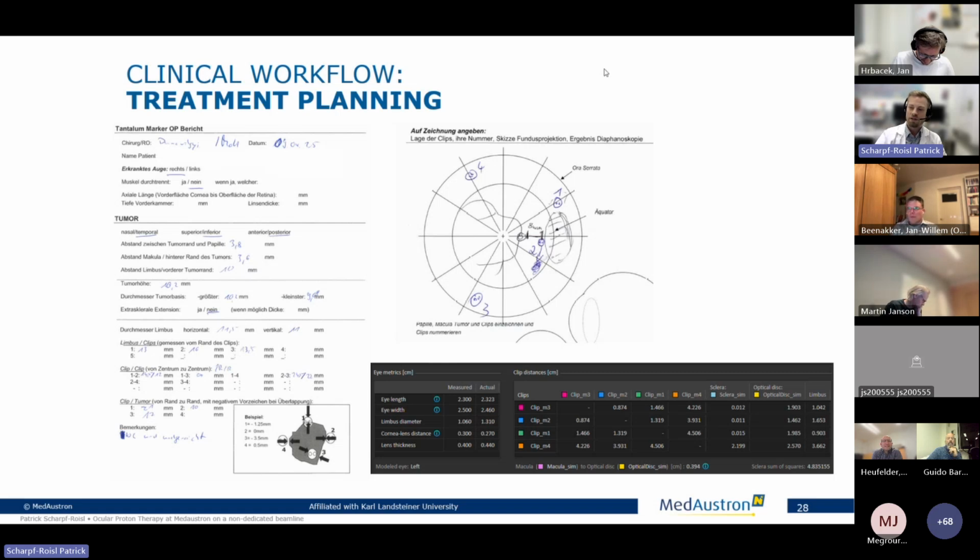We don't visually use the fundus projection, but what we use are measurements that we see and which should be equivalent. So you can use it a bit visually. We scale it to the distance between optic disc and macula to be accurate. And within this area, within a distance of 3 millimeters, it's rather accurate. The further you go from this central path, the less you can trust OptoMap images in general, we have to say. So there we then make the best trade-off.